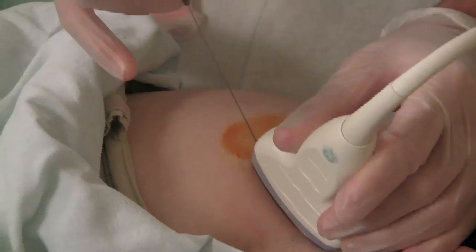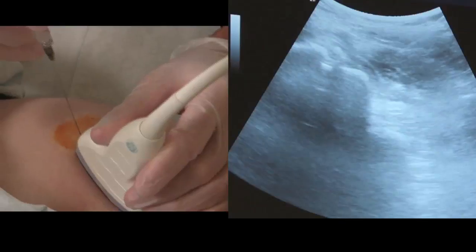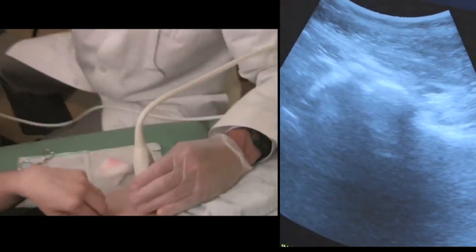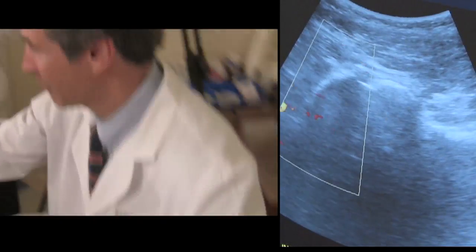You are looking at me injecting this patient's hip under ultrasound guidance. You can see the needle coming into the area of the joint. I've turned on the Doppler to look for blood vessels, which indicate there is a nerve nearby. That's the femoral artery that's pulsating in red.